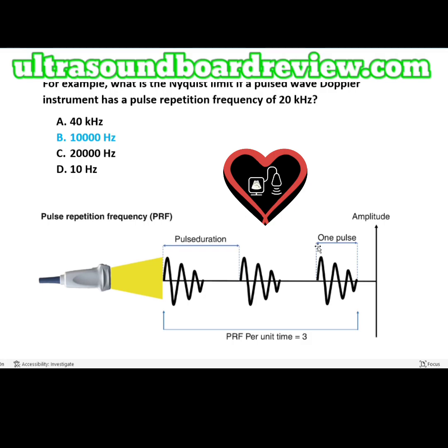And finally, what is the PRF of this image here? Well, the answer would be 3 because there's 3 pulses per unit of time.